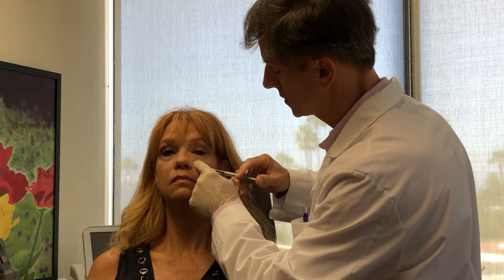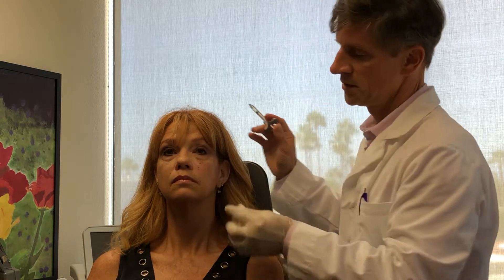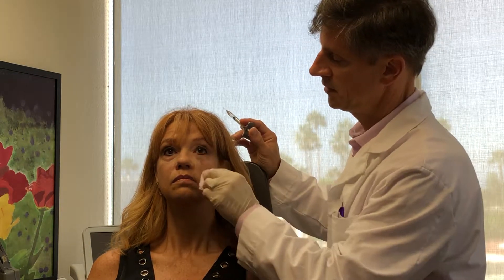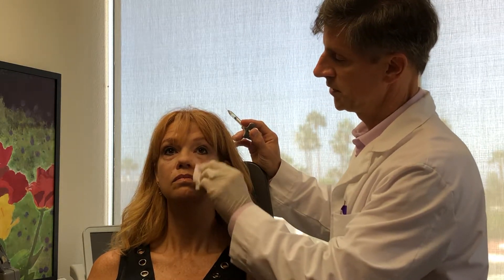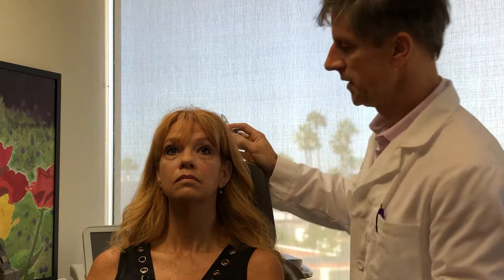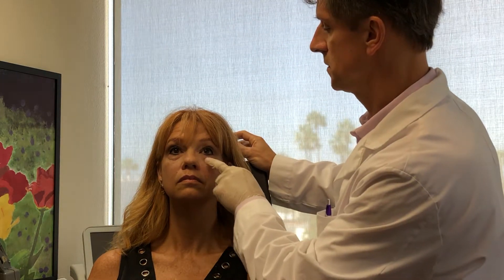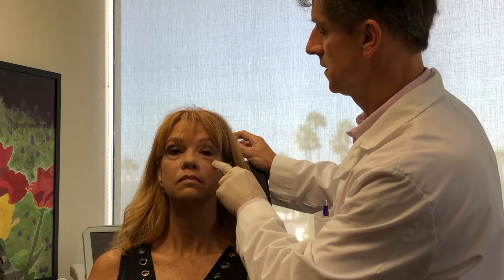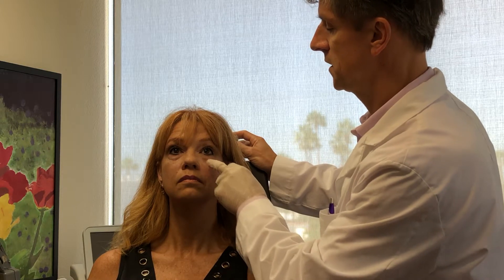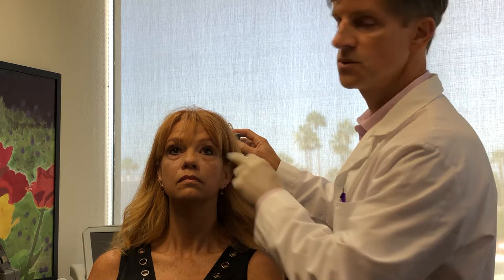Small volumes in a depot form. And once again now, we have a blended transition between the malar and cheek, the nasolabial fold, and we still need a little volume in this area here. When I need volume in this area, I do not use the depot technique — I do resort back to the cannula.